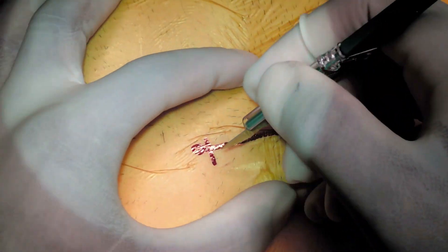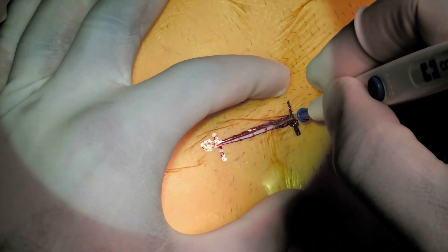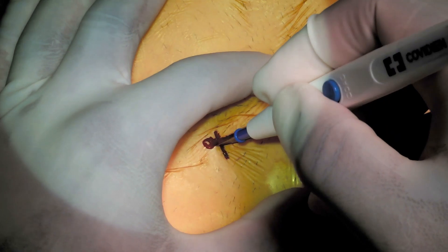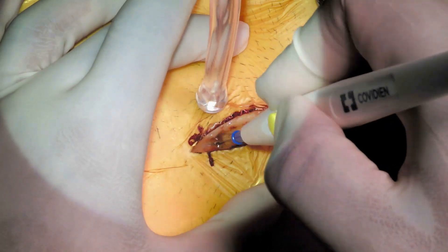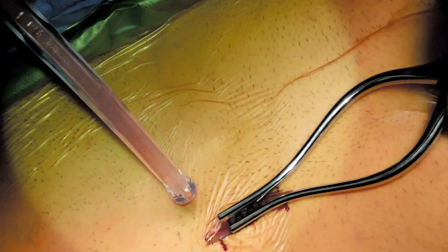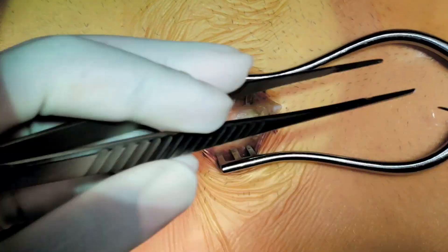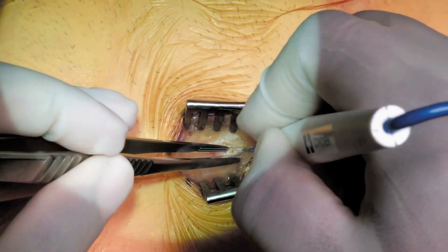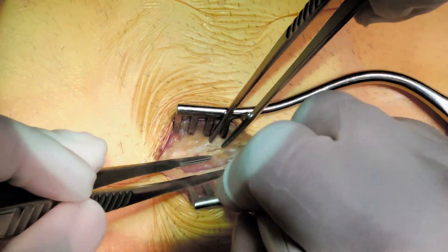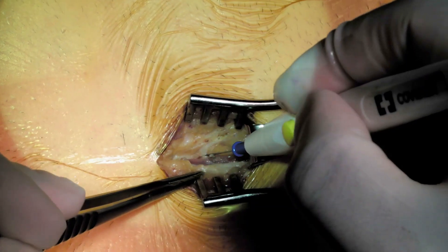Right now I've marked out my incision site. I've taken a scalpel and gotten through the initial skin layer. I then take an electrical cautery device to divide the tissues. My whole goal is to get down to the xiphoid process, which is the most inferior portion of the sternum. I use a retractor referred to as a Weitlaner to spread the tissues.